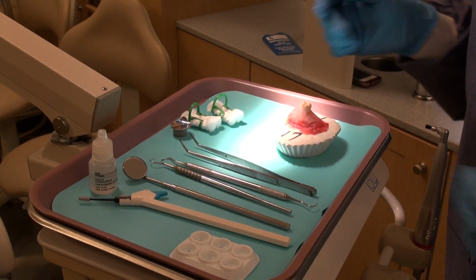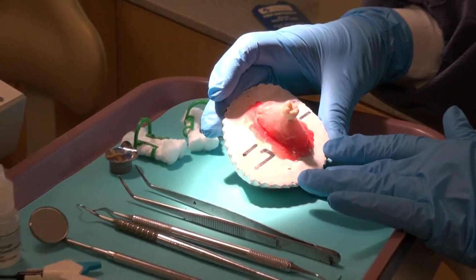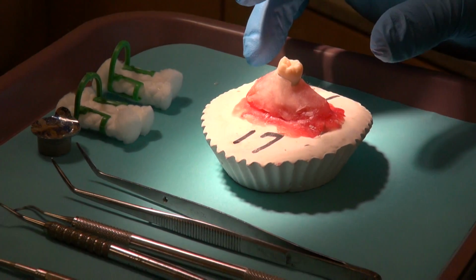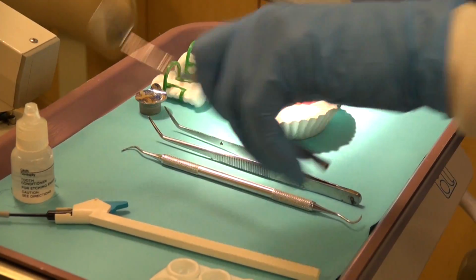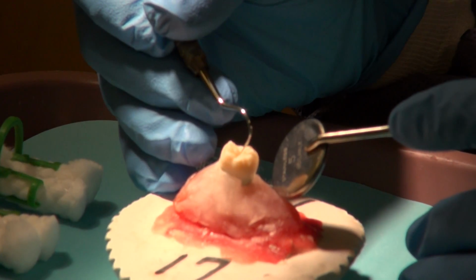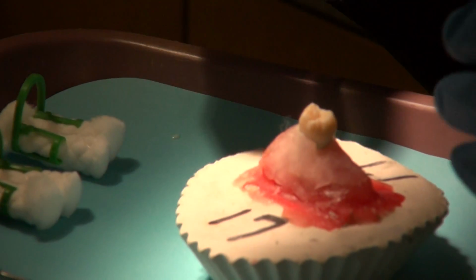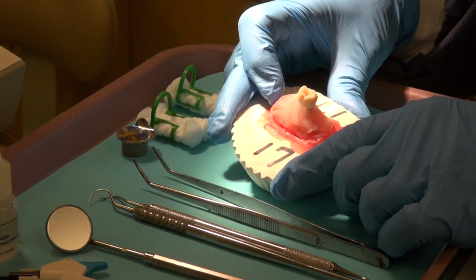Okay, we're going to prepare a tooth to place a sealant today on this extracted tooth. The first thing we'll have to do is recheck the surface to make sure that this is in fact the tooth that we are going to place the sealant. We want to look at the deep pits and fissures and confirm that, yep, this is the tooth. So our first step would be to debride our tooth.